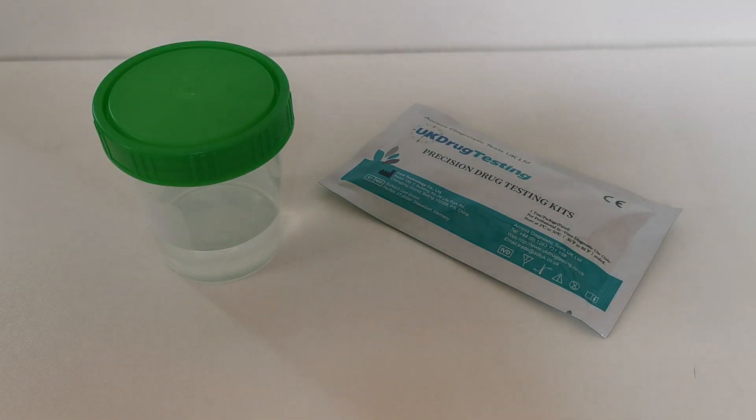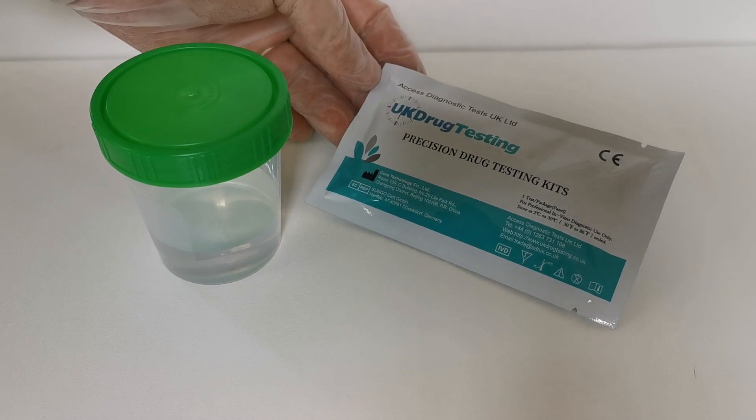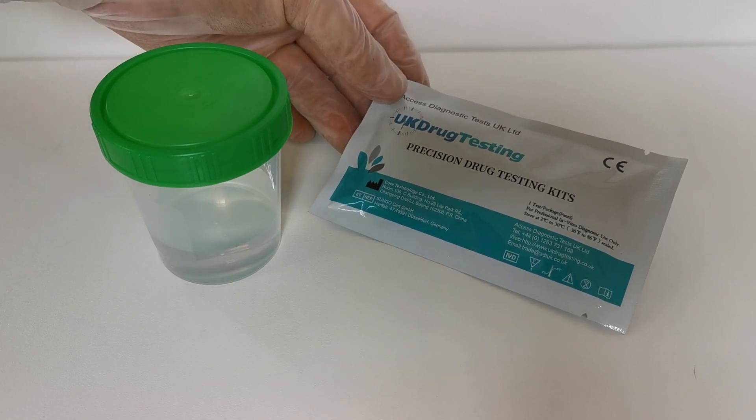Welcome to this drug testing kit and UK drug testing joint presentation on how to perform a urine panel drug test. We're going to demonstrate this with one of the new UK drug testing seven-in-one ultra sensitive drug tests.